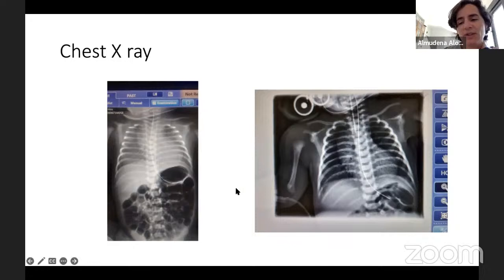That's one of the limitations that we have using lung ultrasound, in which you see clinical improvement after surfactant, but you don't see an improvement in ultrasonographic signs until at least 6 hours after the treatment, because you have to think that you are introducing a liquid inside the lungs. So more or less the images are quite similar until the surfactant is absorbed into the lung and disappears. But you can see a clinical benefit before you see an improvement in the images.